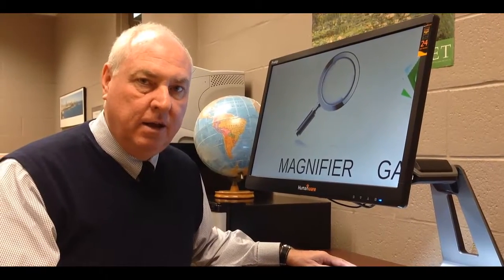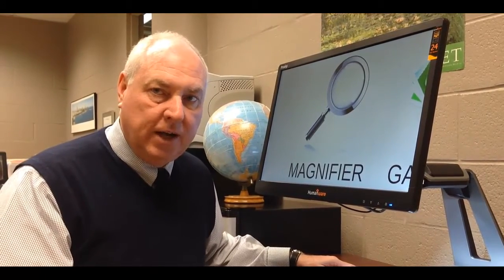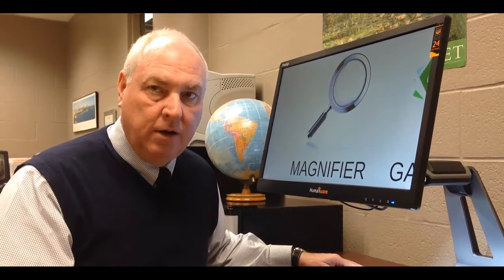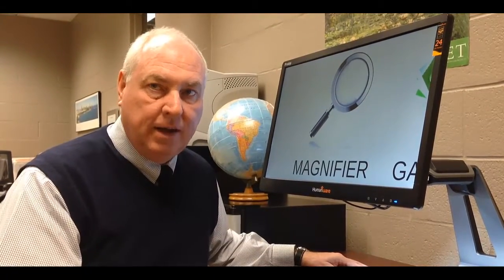Hi, I'm Tom Persky, and I'm going to talk today about the new HumanWare Prodigy Desktop Unit. The Prodigy actually has three models: the desktop unit, one called the Prodigy Duo which has a tablet as well as the desktop CCTV, and there's a tablet that comes by itself, a small 5-inch tablet. But the new desktop unit is just out, and we're excited to show it to you.